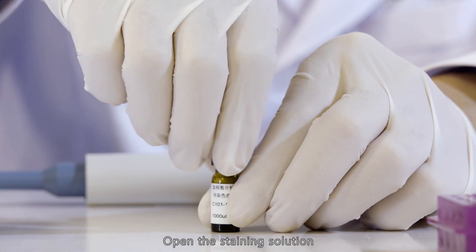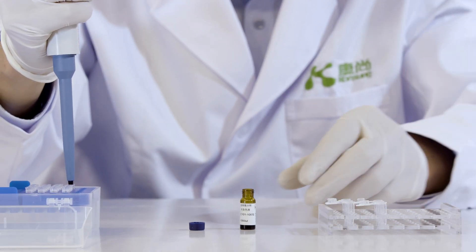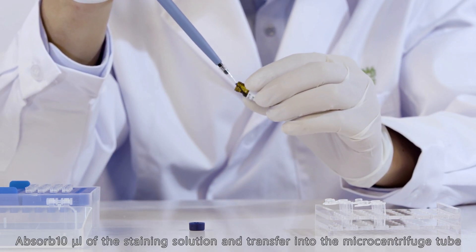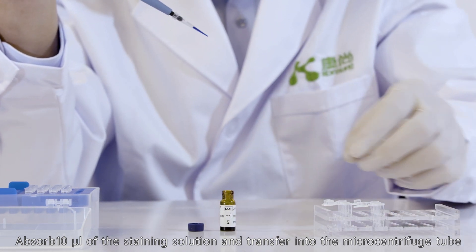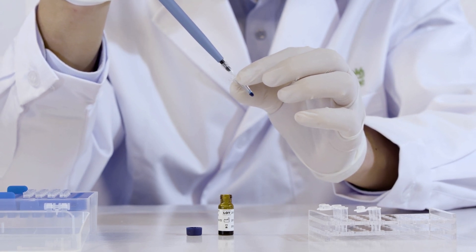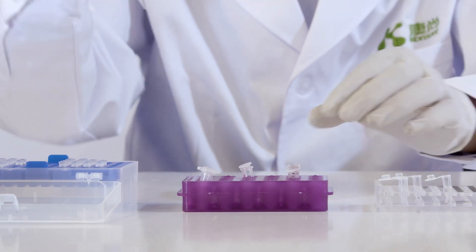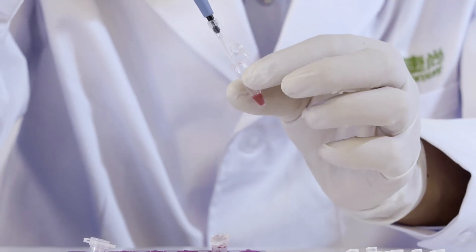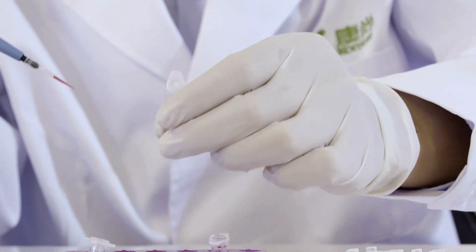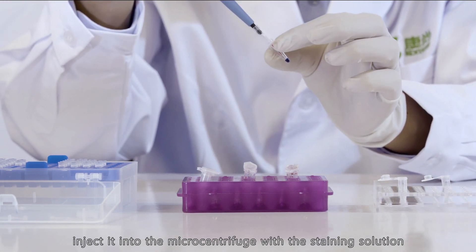Open the staining solution. Absorb 10 microliters of the staining solution and transfer it into the microcentrifuge tube. Then absorb 10 microliters of the mixed blood sample and inject it into the microcentrifuge tube with the staining solution.